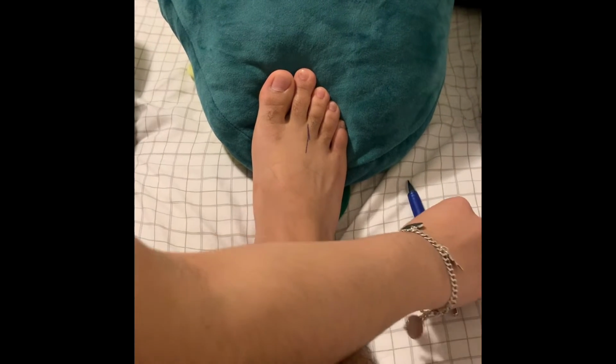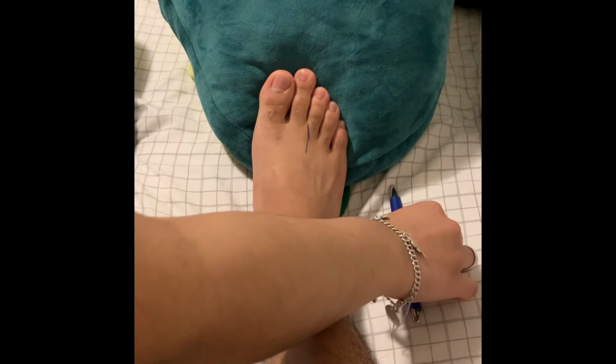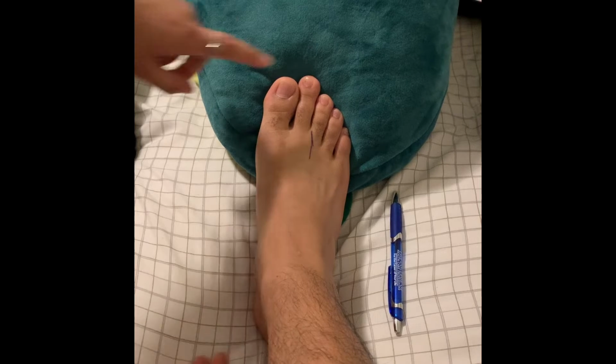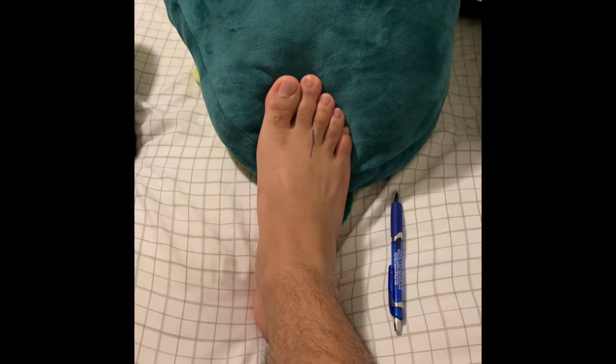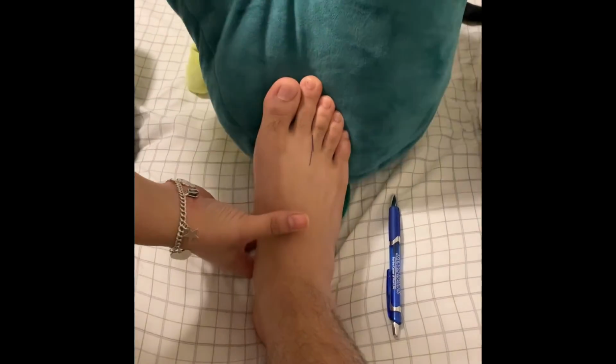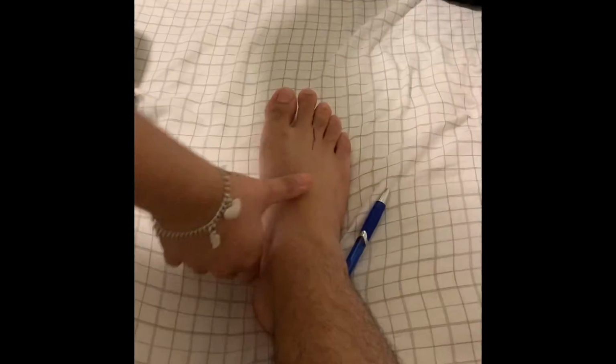Make sure you have the marker somewhere on the picture, and you always want to make sure that you can see the heel and the toes. So we're going to take the picture. You take it. It's done. We remove the avocado. Place your foot down.